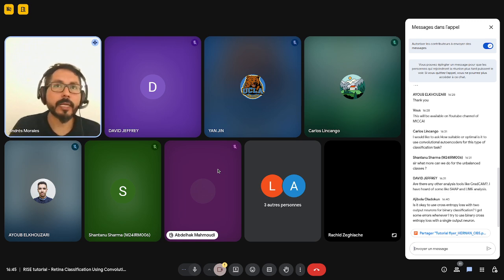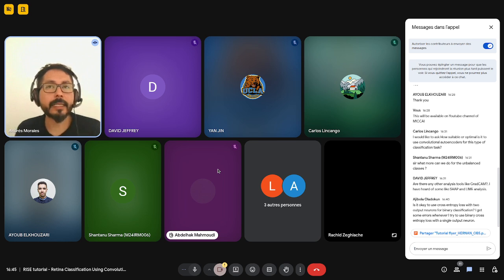Variation in contrast and brightness can be common from using different cameras and different microscopes, but they also should be mild. So you cannot use high values there as well. So you have to be very careful. And there are also, for example, elastic deformations, and elastic deformations are the ones you have to be the most careful with, because they can actually change the shape of the object that we want to analyze. So these are mostly not recommended for most cases in medical imaging.